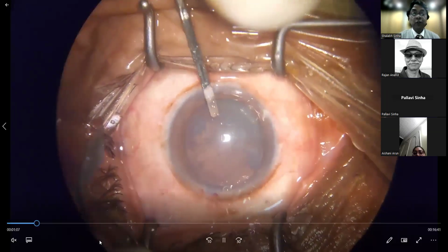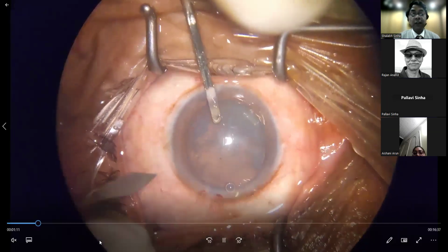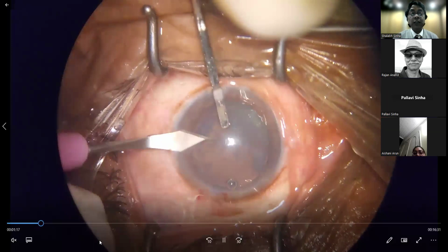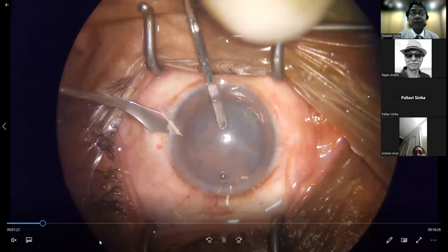This is a 2.2 keratome. A small groove is fashioned in the limbus, and then the keratome is introduced through that groove into the anterior chamber, and it is slightly enlarged.